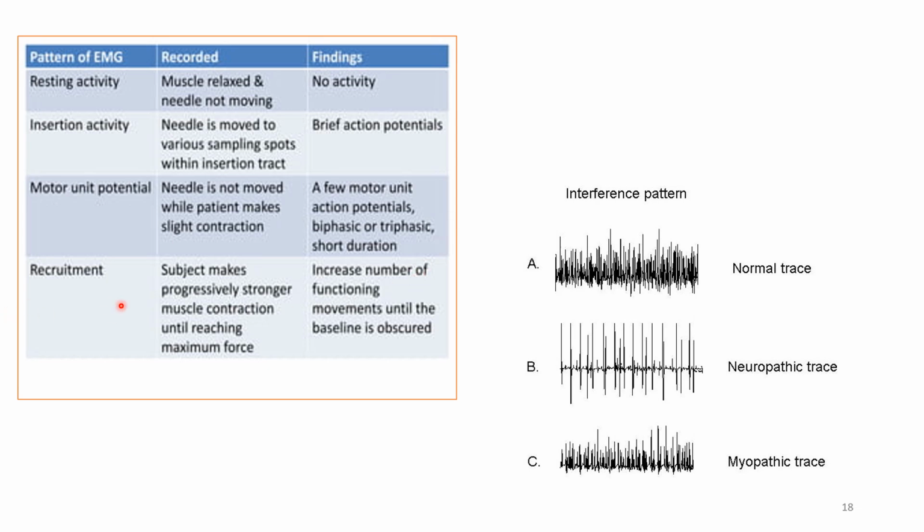Now, what does recruitment mean? The subject is asked to make progressively stronger muscular contraction until he reaches the maximum force. What you can observe is an increase in the recruitment of the motor units and an increase in the number of action potentials.